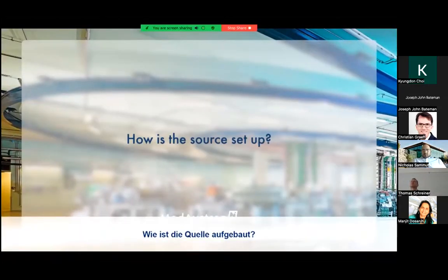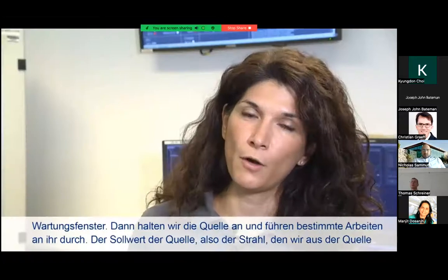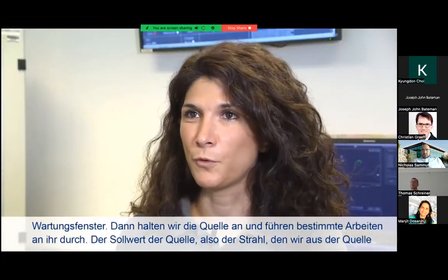How is the source set up? The sources all run in parallel. They are basically never stopped. They run continuously 24 hours a day, except when there is a maintenance slot. Then we stop the source and we do certain work on it.